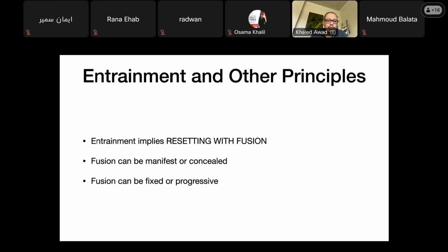All right, entrainment. We don't have time to talk about entrainment in detail today, but I could not not mention some of the principles of entrainment. This is really worthy of at least an entire lecture, if not more. But entrainment, generally speaking, implies resetting with fusion. We have a tachycardia that we're able to reset, and we're able to reset it with fusion. And that means macro reentry. So that's what entrainment means.